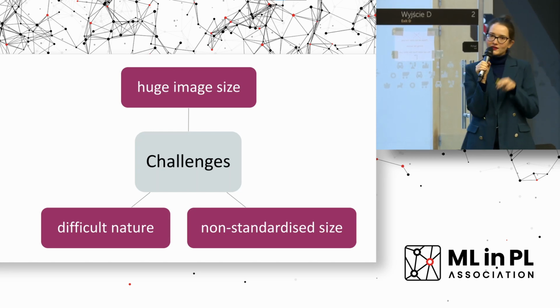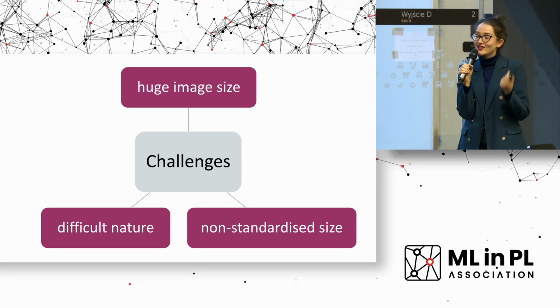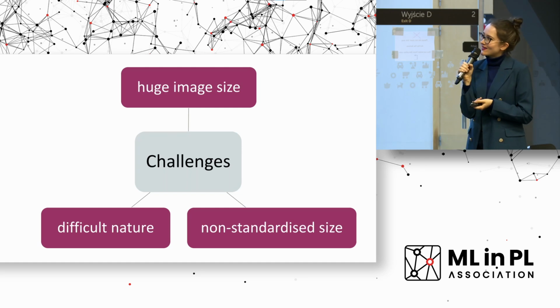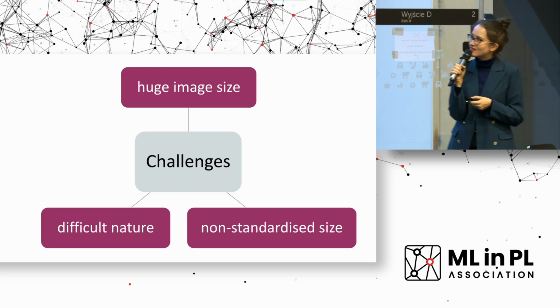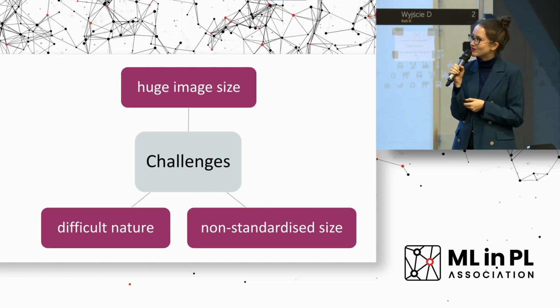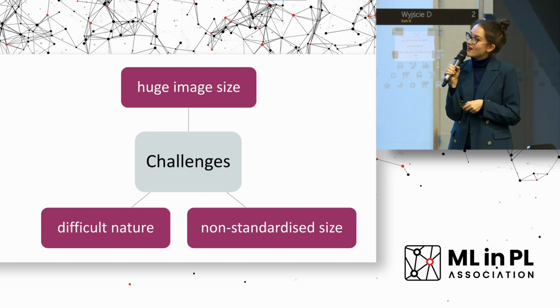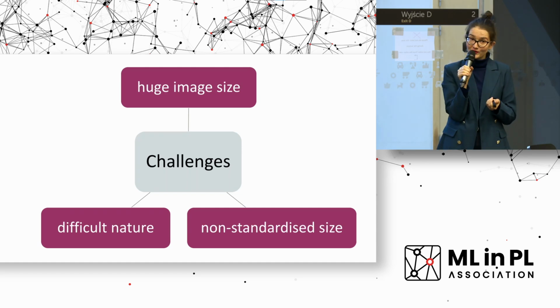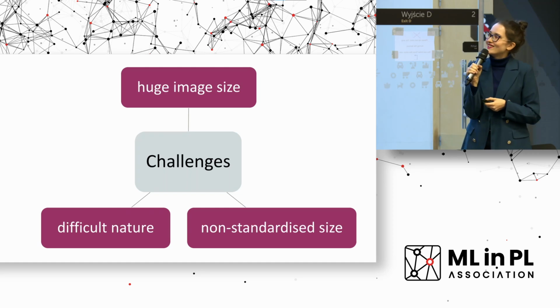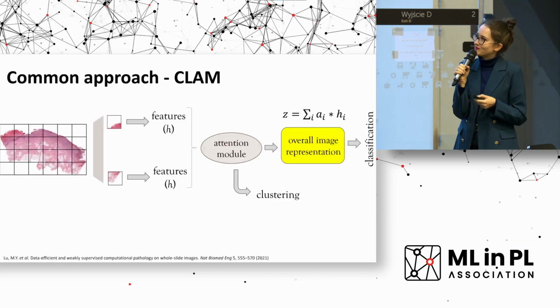Apart from the technical problems, we also have another problem that makes the task difficult: we have to inspect the tissue taken by a physician very carefully, because we can see individual cells. So we have to analyze it carefully, and this is why the work of histopathologists is difficult, and also why training an appropriate neural network system is difficult.